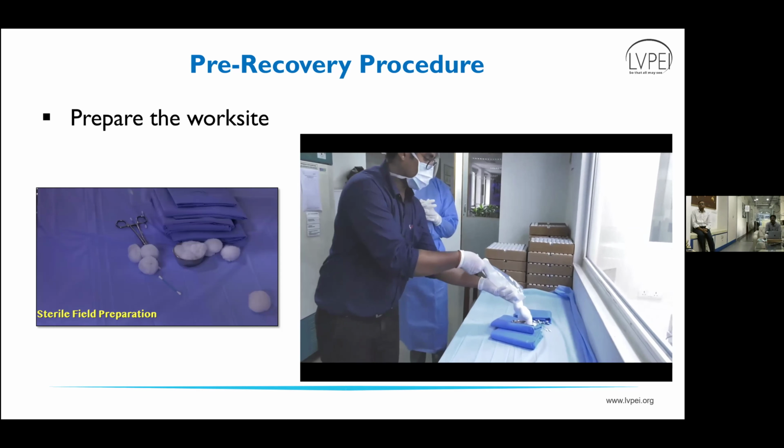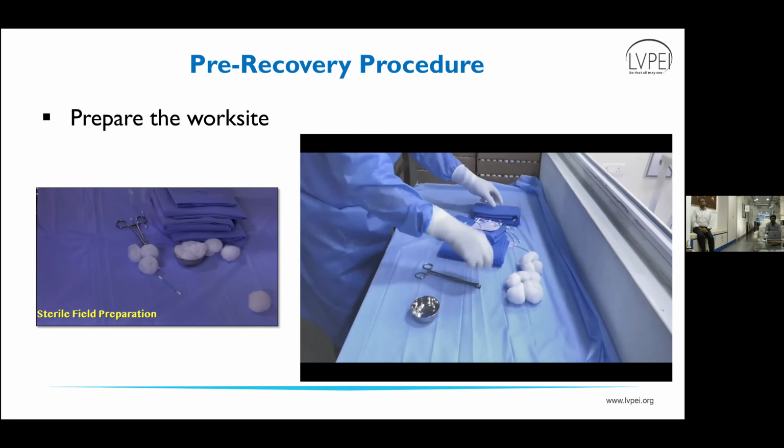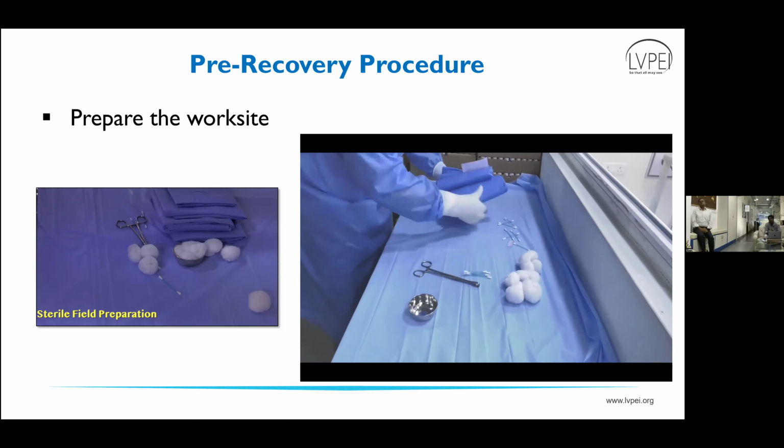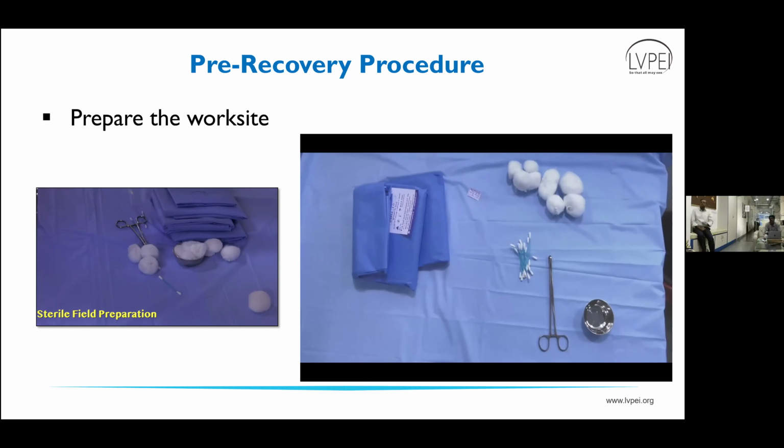So this is all. We have to set up the things in such a way that the body drape, head drape, and eye towel are kept a little away from the cotton balls, cotton buds, sponge holder, and sterile bowls. The materials on the right side we use for the aseptic procedure, doing the povidone and iodine cleaning, and the drapes on the left side we use after the aseptic procedure to drape the body.